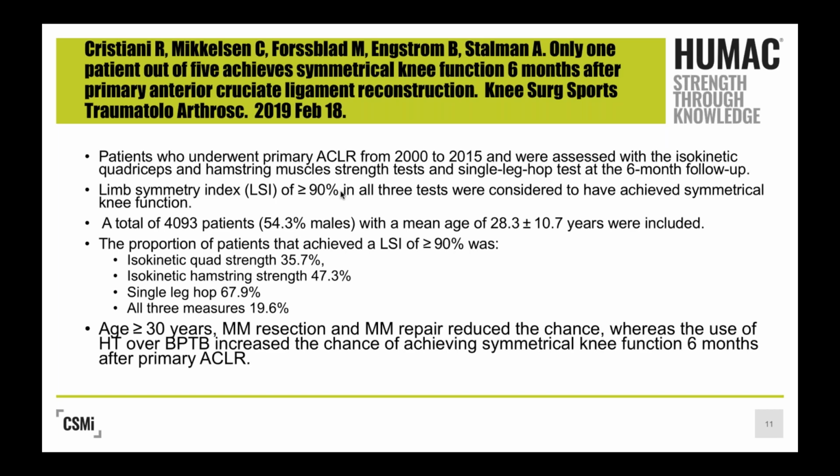So this study shows us a few things. One, subjects do better on functional tests at this point than they do on isolated muscle tests. The function of hopping improves faster than muscle strength. And we're going to see in a few minutes how patients compensate functionally. We have evidence of how they make compensations in order to hop. And those compensations aren't going to set them up for success.